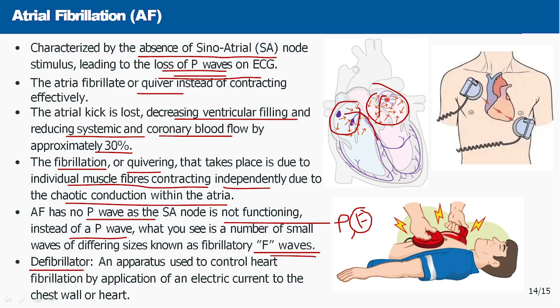So a defibrillator can be used. You can see here, this is the defibrillator. An external supply is given to coordinate the heart again. It is applied to the chest wall so that it can be in sync again, or be synchronized.